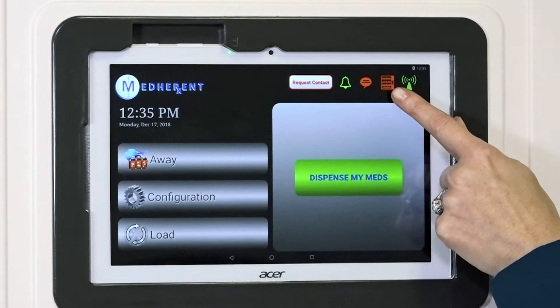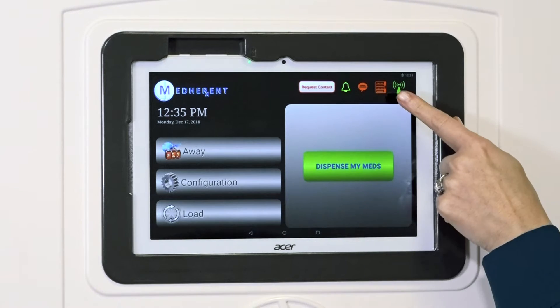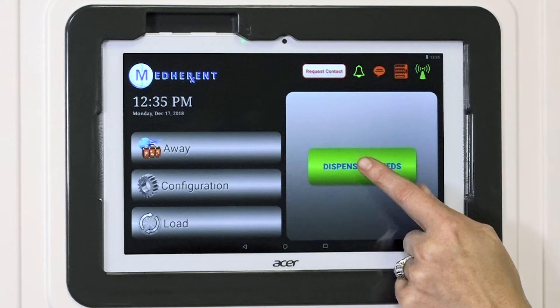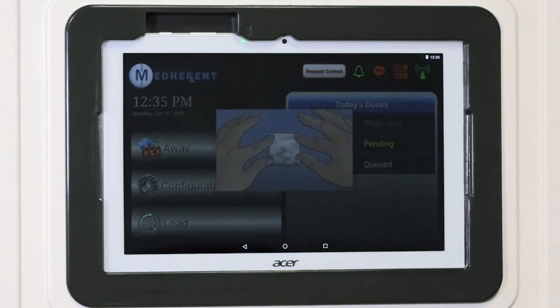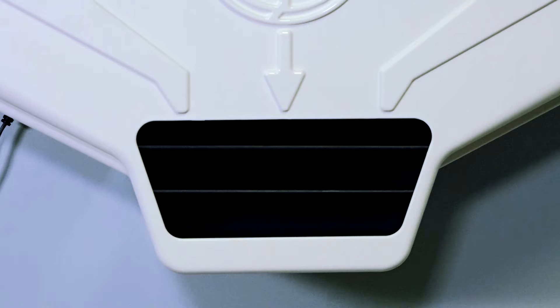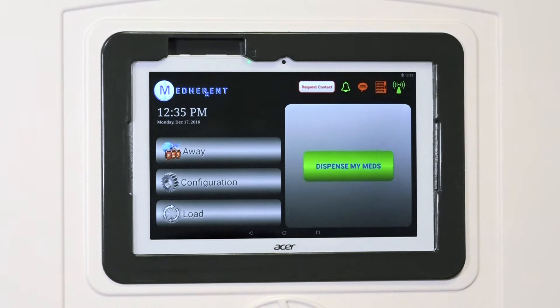This icon looks like a vending machine because it represents the mechanical system that actually turns the coils inside the machine. Most of the time, this icon will be red, so you shouldn't be worried. However, this vending icon should turn green when the coils are turning inside the machine and will turn back to red once the medication packet drops into the retrieval area.